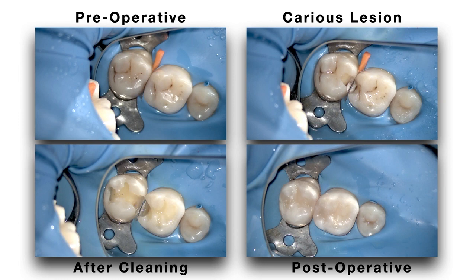Some people do not pay attention to this point, and later on they say, why are you doing one composite, and now you are doing another one? So you can show him these pictures. Here you have a caries, and I take permission at the beginning. So it is a kind of legal protection. It's very, very easy with the dental operating microscope to take a still image in a second. No need for time, just during the work, click, click, click. You can take a picture or a video.